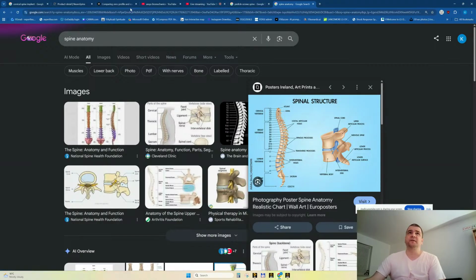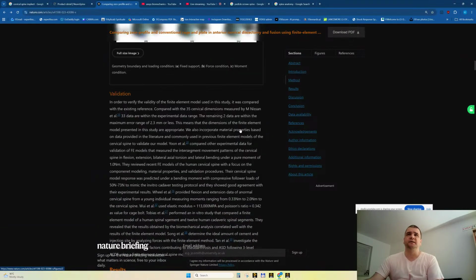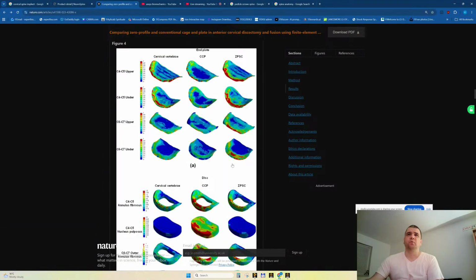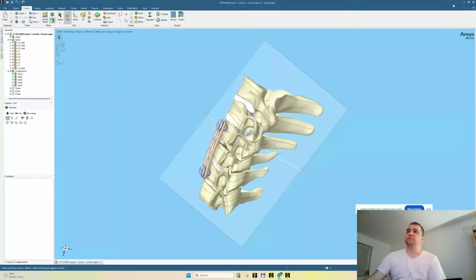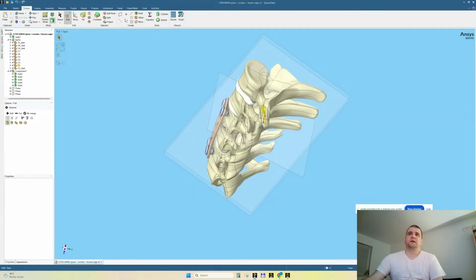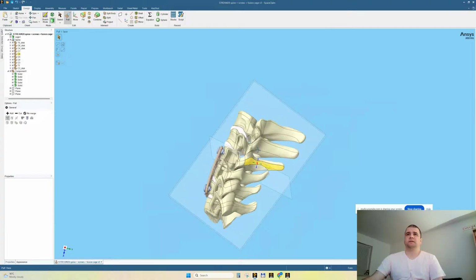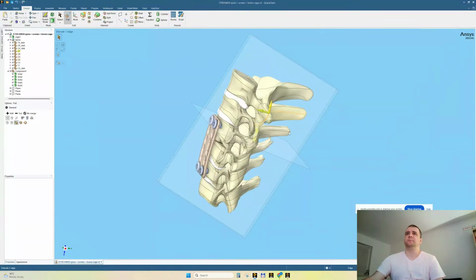They are cut from the 3D model, and I dare say they are also not included in the FEA. They exist here just for show, but they are not included in the FEA. I do not see these processes, they are cut. Which leads me to the conclusion that I will kind of ignore them. I will not cut, of course, but I will also not make these small cartilages. No, I will not be making them. Let's save again and move towards the simulation.